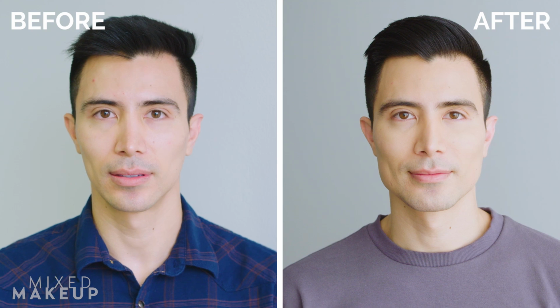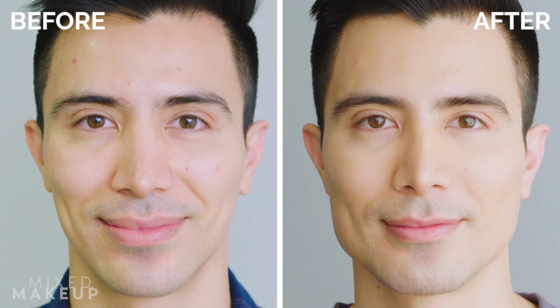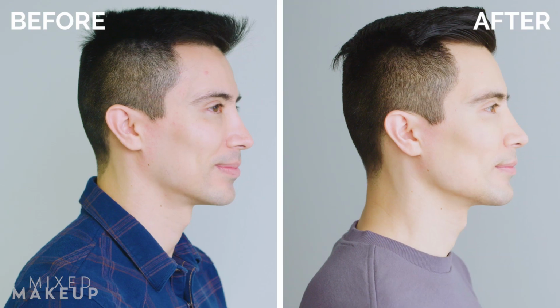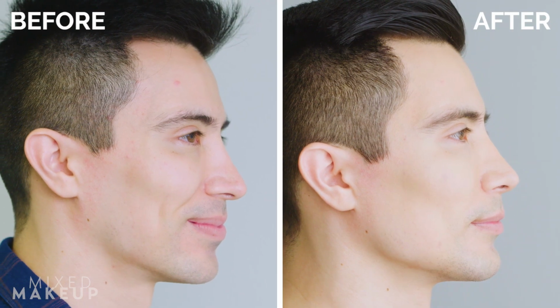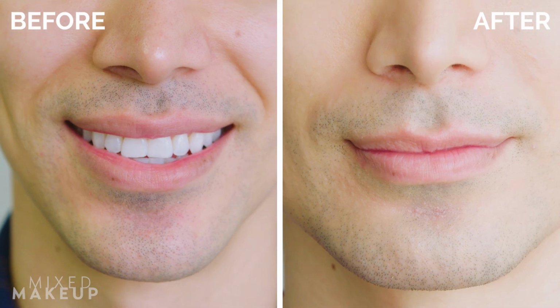So that's one of the powers of the custom implant, because you and I spent a lot of time going through the design process, what you wanted. The 4 things that I really love to see right now is that we have that angulation here. The width is really nice. We have that little bit of concavity, that little chisel that goes in before the chin starts. We have the squared chin. And of course, we got that projection forward.